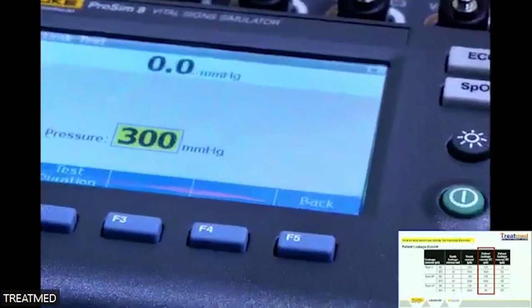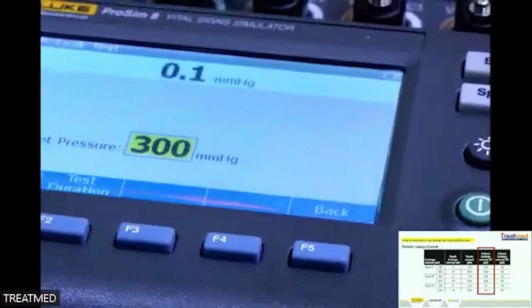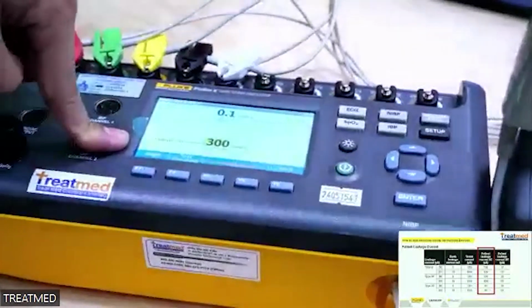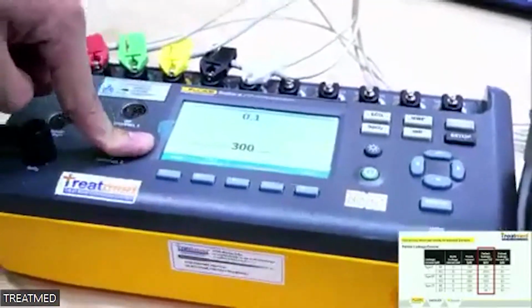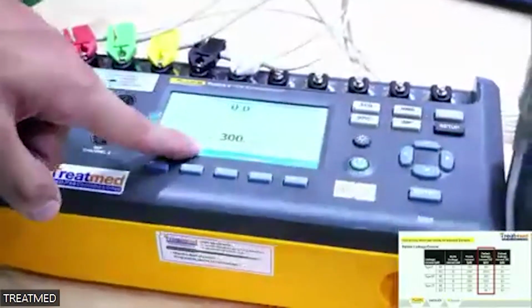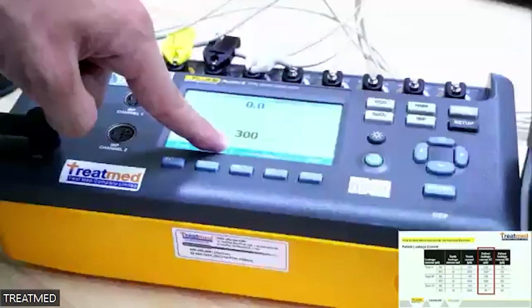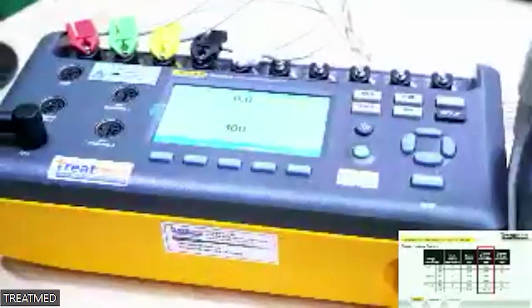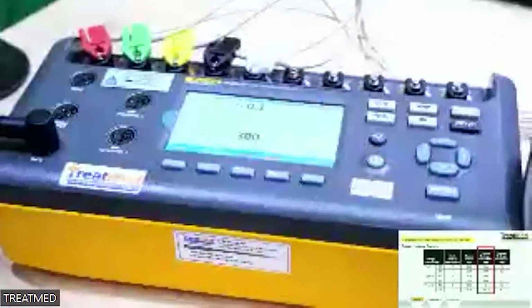For the leak test, we must set the target pressure high, because when the high pressure is not reached, a lower pressure is not reached either. We recommend setting the target pressure to the maximum pressure the pressure meter can receive. For the leak rate, the ECI recommends not exceeding 4 millimeters of mercury per minute.